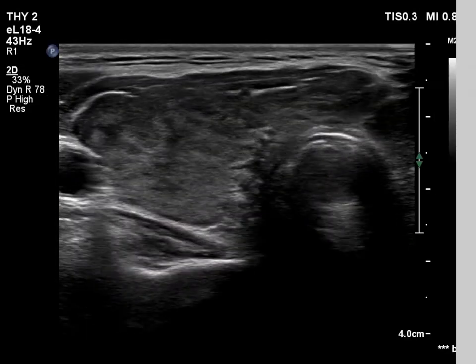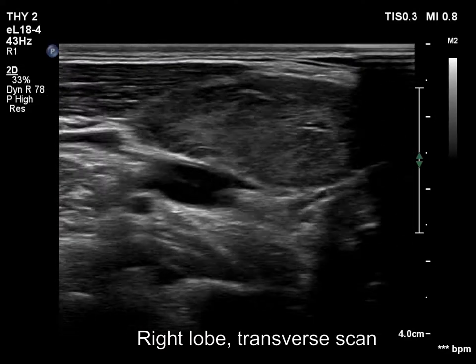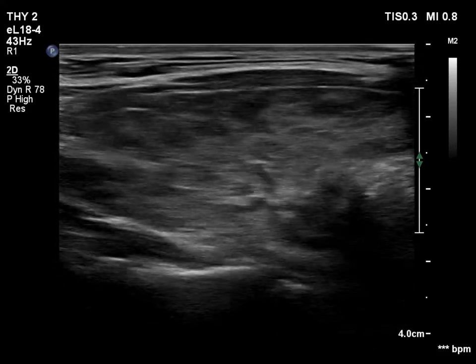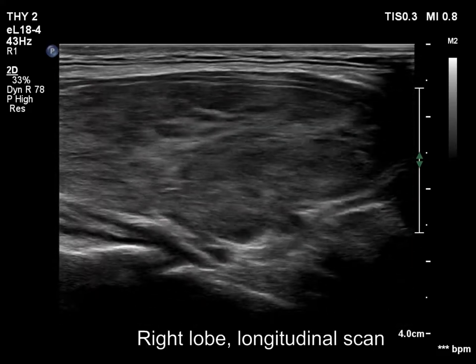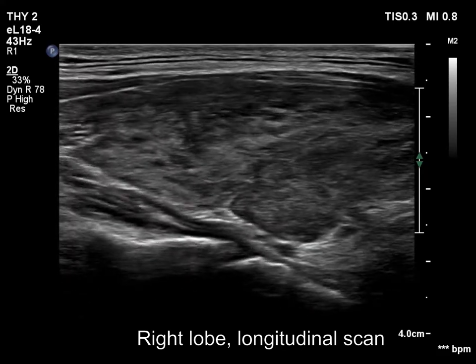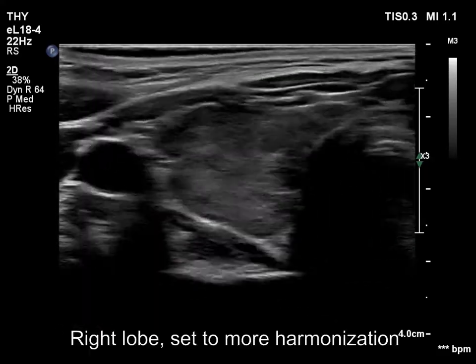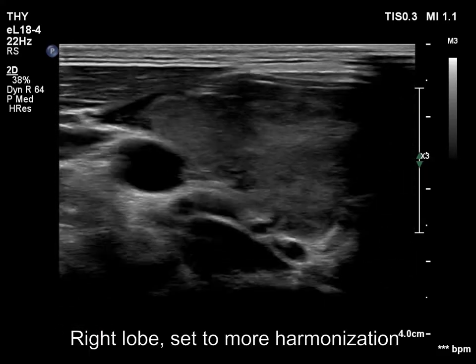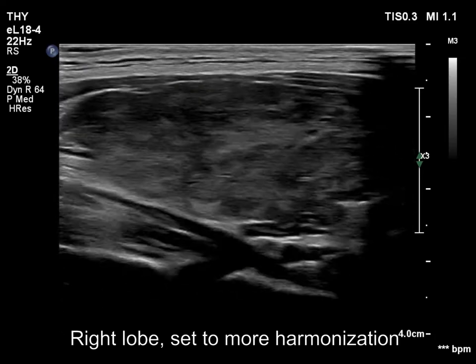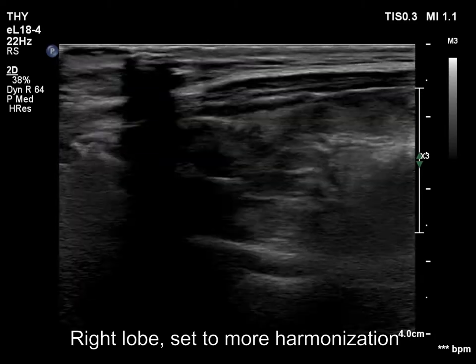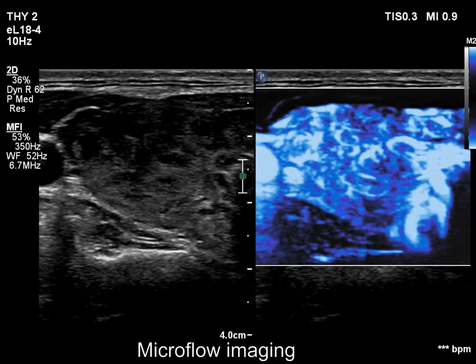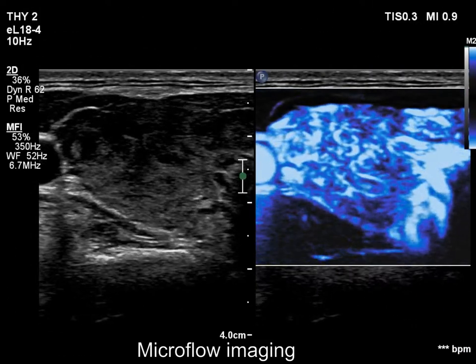Compared with the former exam, the thyroid has decreased in size and a much greater part of the lobe has become echonormal. The hypoechoic areas can be seen as discrete lesions, and the echonormal fields have increased. With a better resolution setting, parts with different echogenicities are separated much more sharply than they really are. The vascularity is still increased.